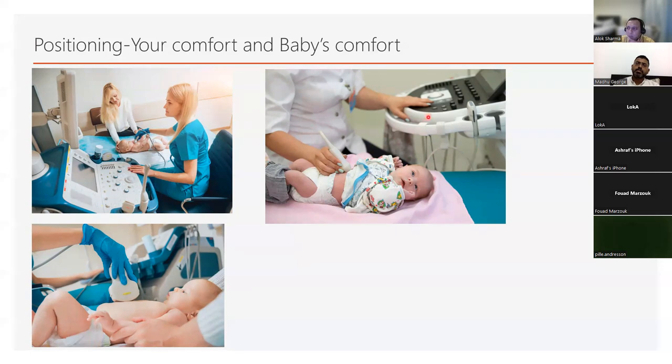Okay. What about the image on the right here? What's wrong with this? Exposure. Yeah, it's a disaster. Can you imagine starting your scan? You probably get the anterior regions, but good luck trying to get the lateral and the posterior regions. But can you imagine if you start your scan, you then start undressing the baby, how upset you're going to make this baby? So, I would call this, you've started a scan without adequate exposure.